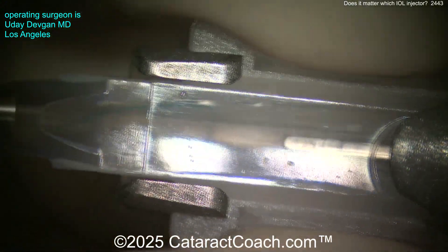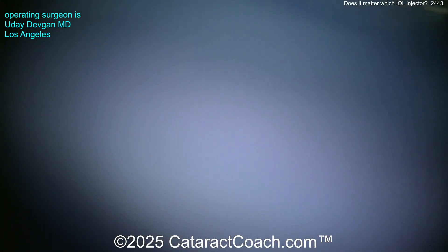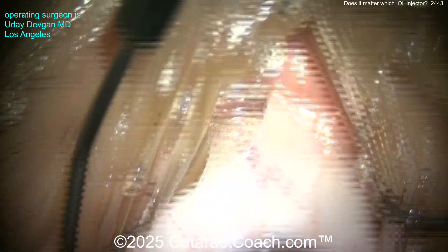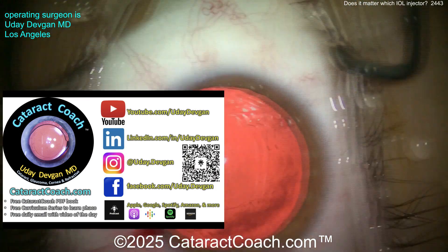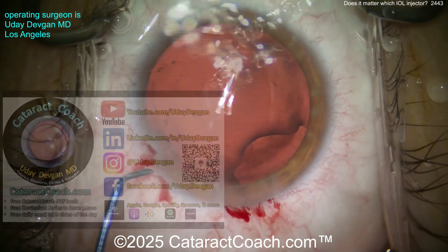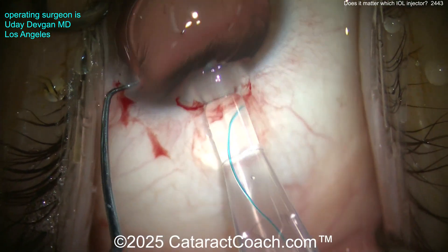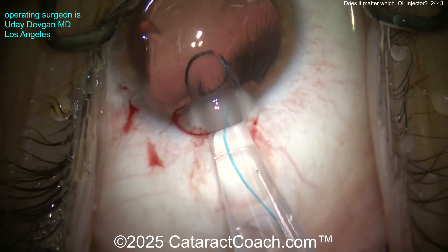Yes, it's perfectly fine — it works beautifully. I like this injector because it gives a lot of control. You can see the haptic is turned in one direction as we place the lens. We need to get the correct orientation. Now here comes the lens — where is the haptic forming? The haptic is going the wrong direction. Remember the 7L rule: the leading haptic should look like the number seven.